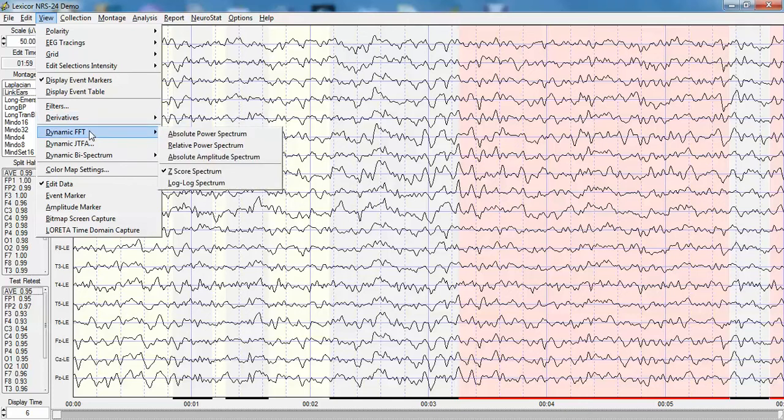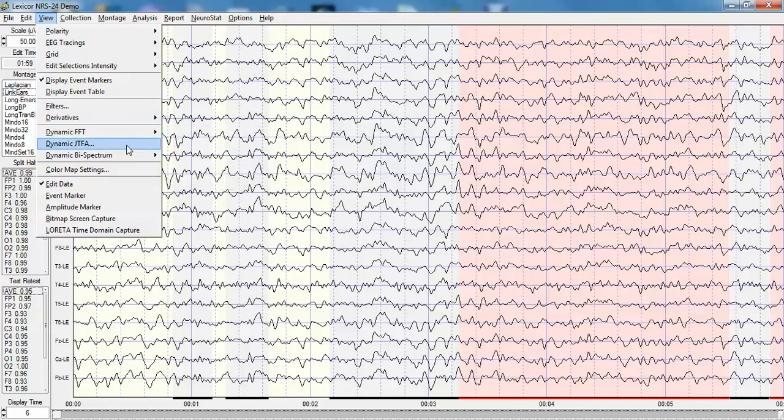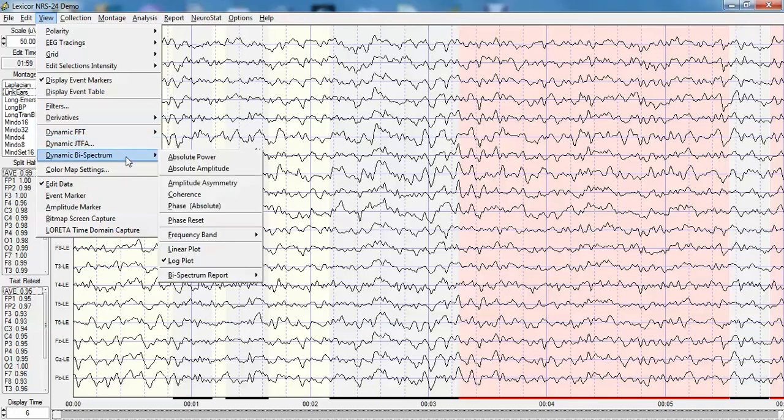One can then compare the EEG to a normative database for absolute power or relative power, or look at a dynamic joint time frequency analysis using the Hilbert transform. One can also evaluate EEG using what's referred to as the bispectrum.